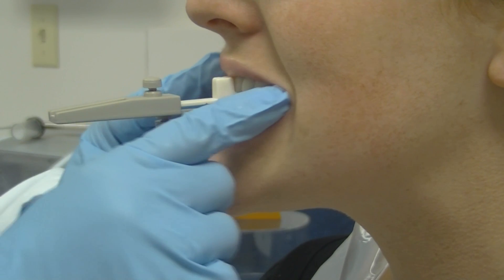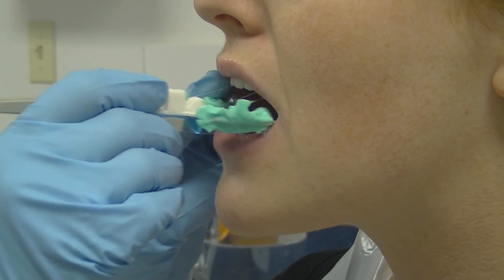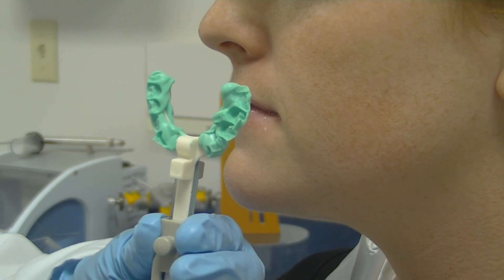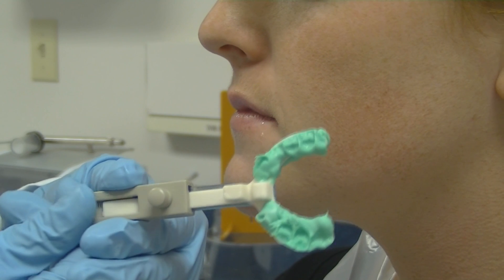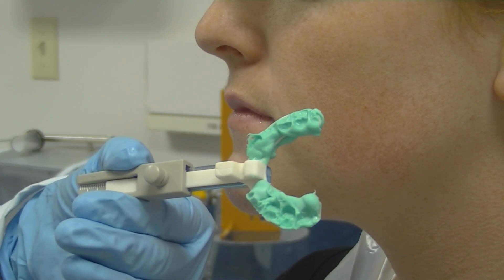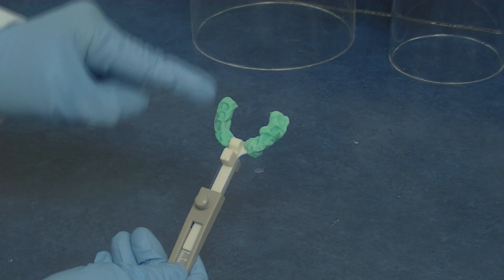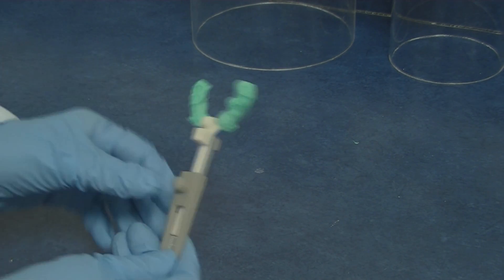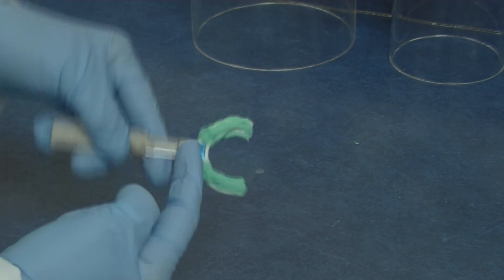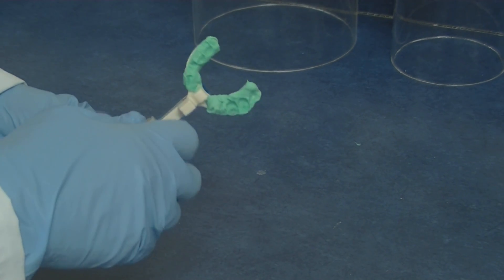Once your material has set, simply remove it from the patient's mouth and take a look at it to make sure that nothing is in that area that will affect the vertical of the bite registration. You can see here on the upper we've got a nice indentation of the upper teeth and nothing on the anterior region. Same thing with the lower — nothing on the divot for the lower teeth as well.